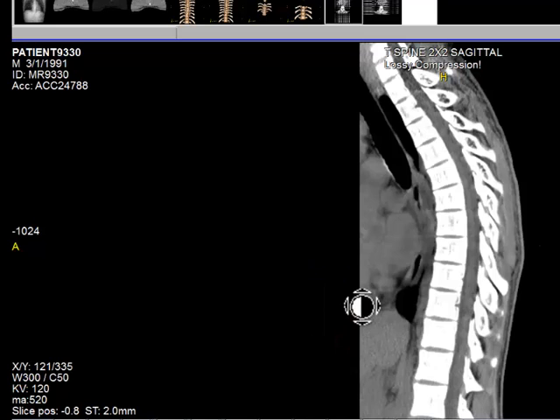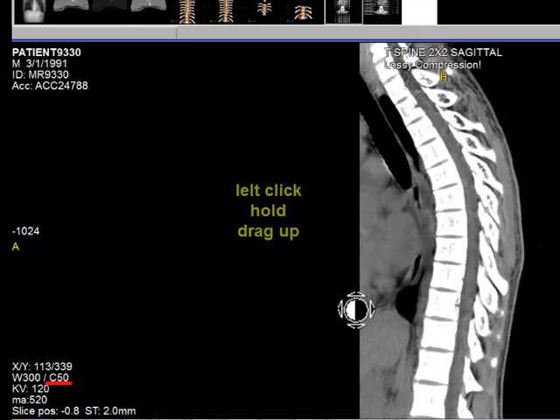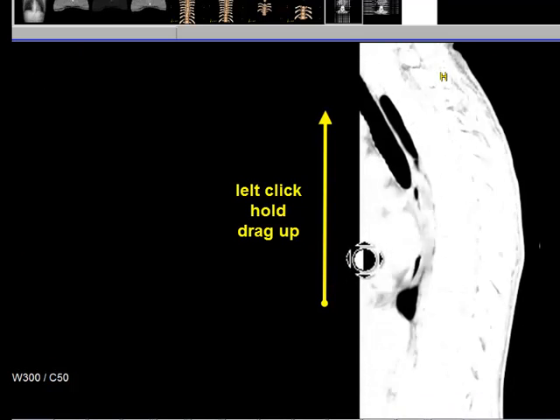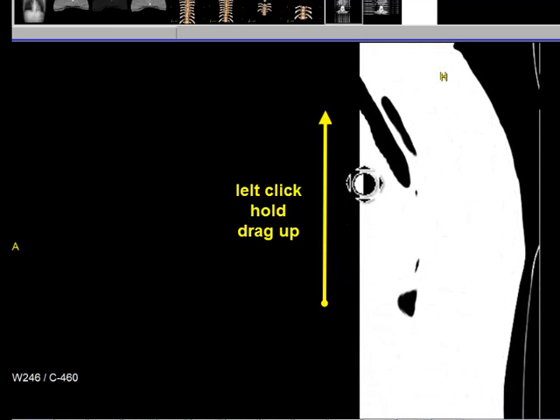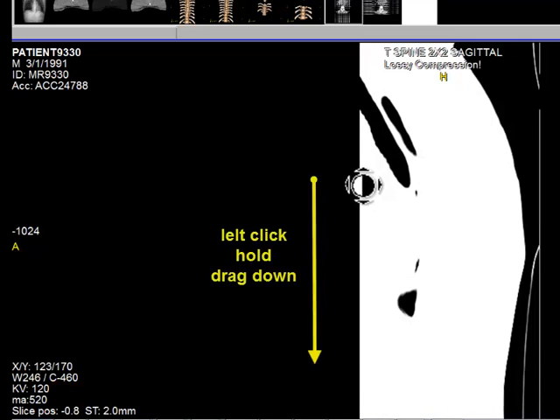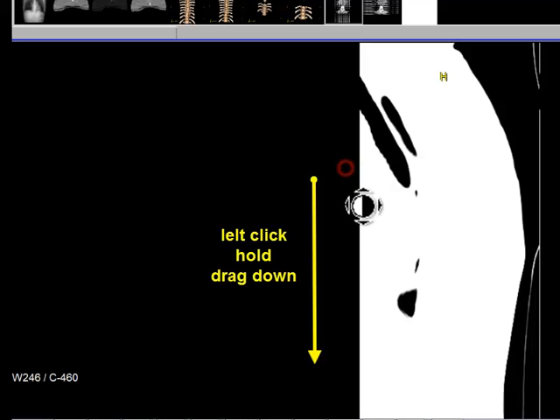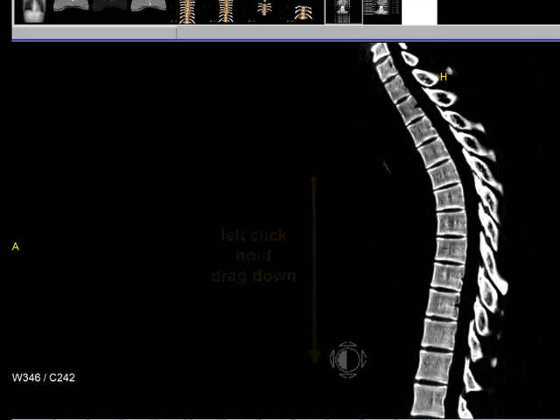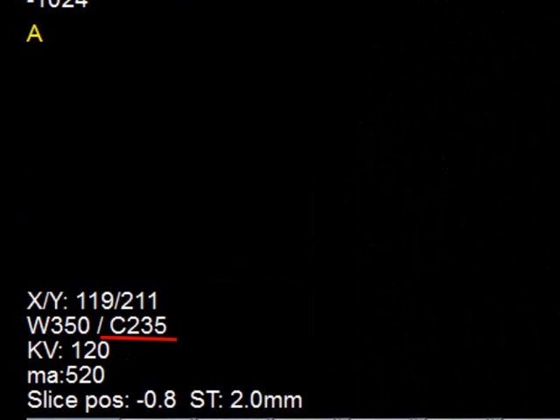I have a centering right now of 50. If I left click, hold, and drag up, you see that the centering goes to negative 460 — it gets smaller. If I left click, hold, and pull down, I go to a higher value, in this case 235. This ends the tutorial on windowing.